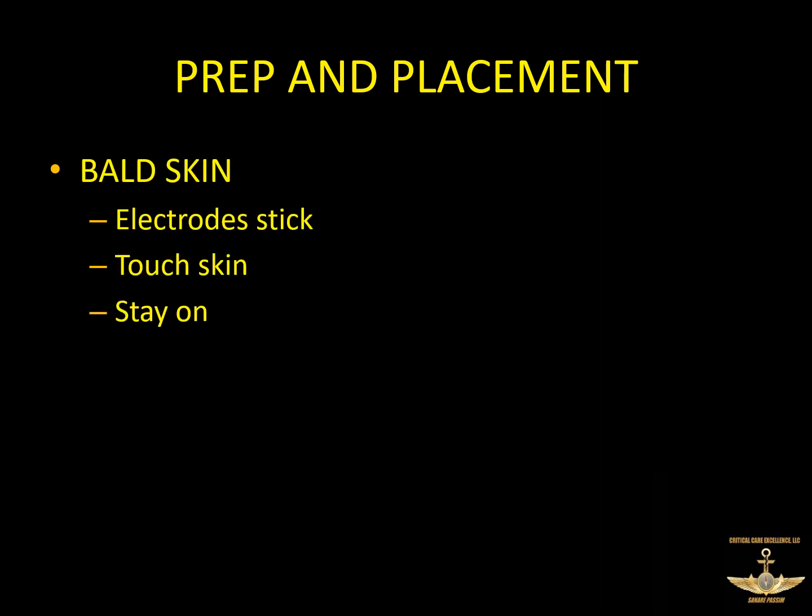The next thing you want, and this is more important than a lot of people make it, is you want their skin to be bald. This obviously is much more important with men because they tend to have more chest hair than women. If you have less hair or no hair on the skin, the electrodes tend to stick better. They also tend to touch skin better and stay on better.